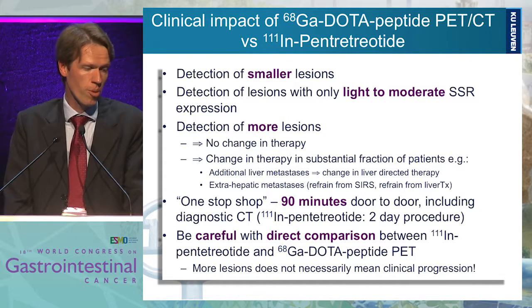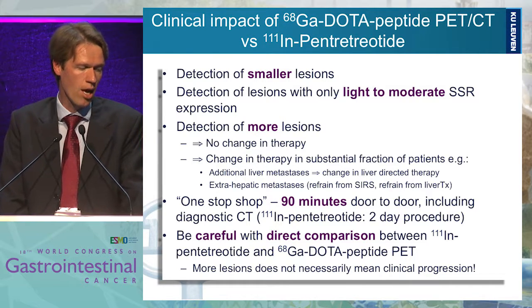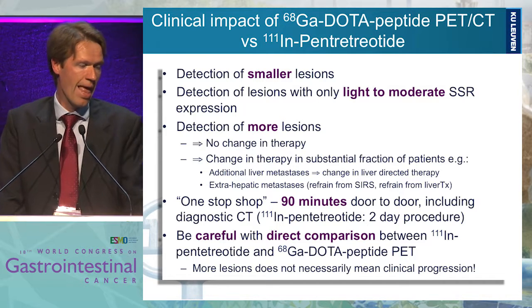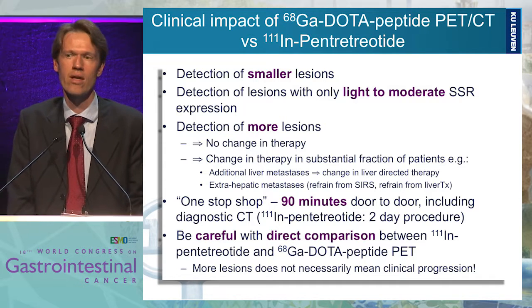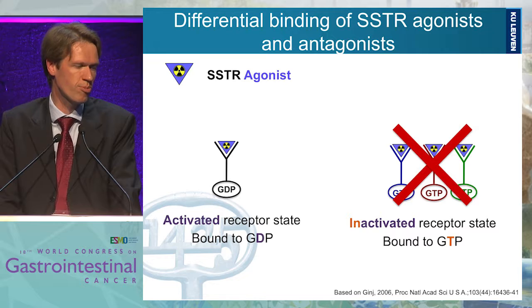We can do a one-stop shop. It's only 90 minutes for gallium-68 on a single day. The indium pentetreotide patient needs to come back to the hospital after a night. And we need to be careful when comparing the indium-111 data with gallium-68 PET because we see more lesions and it's not necessarily disease progression.